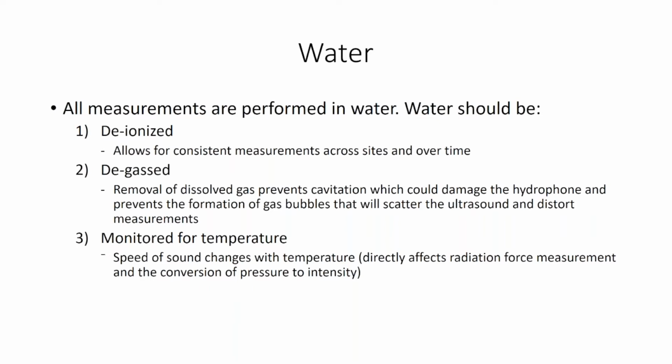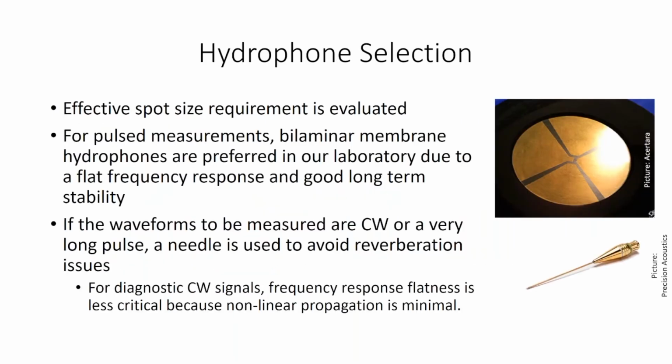And I believe that's one of the primary reasons the standards have settled on measurement at room temperature, where it is very easy to get things to have a stable measurement environment.